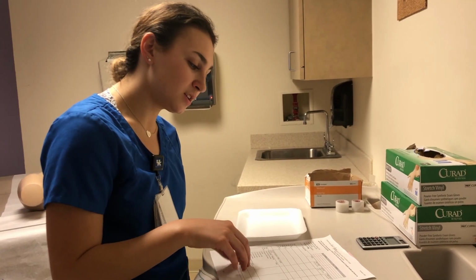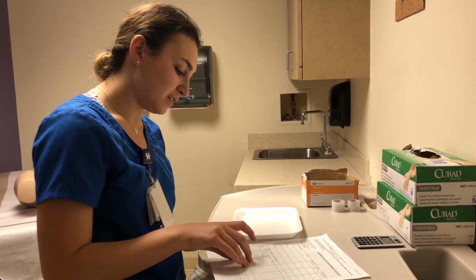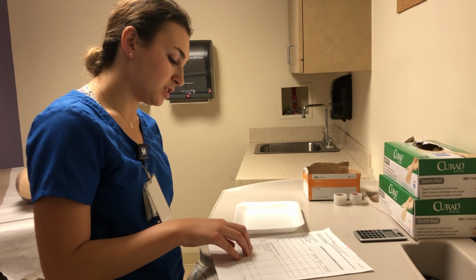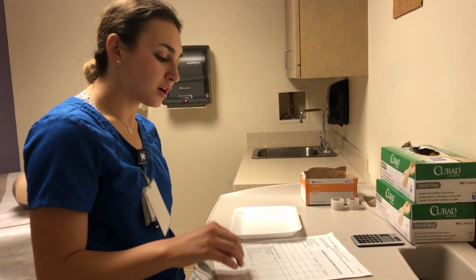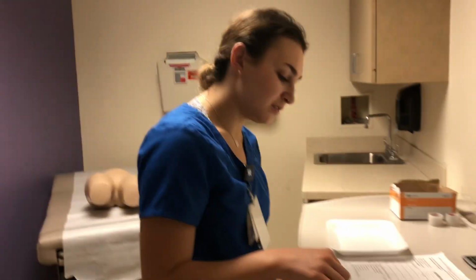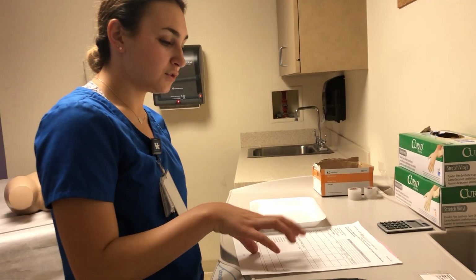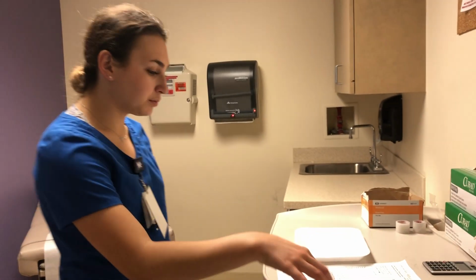We are administering this because my patient's blood sugar is 256, and I will be giving 6 units because it is within the range of 251 to 300, and that is what the order specifies. It is currently 11 o'clock in the morning. The patient has had no previous injections on this 24-hour MAR, so it is safe to administer. So now I'm going to be gathering my supplies.